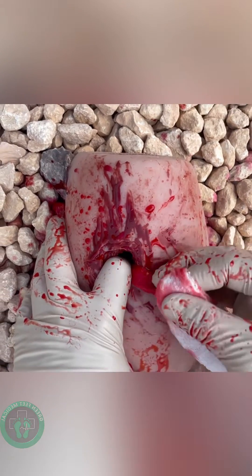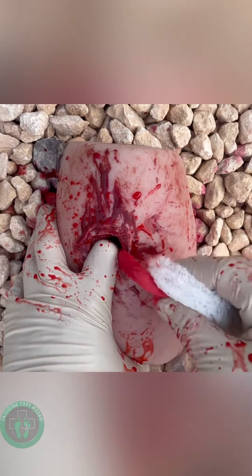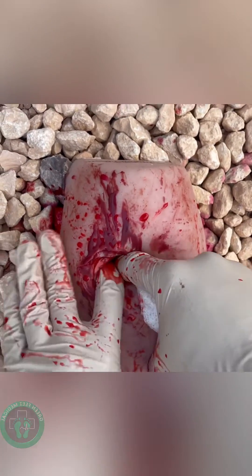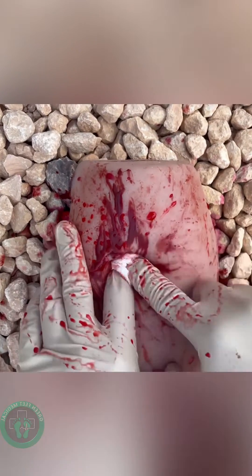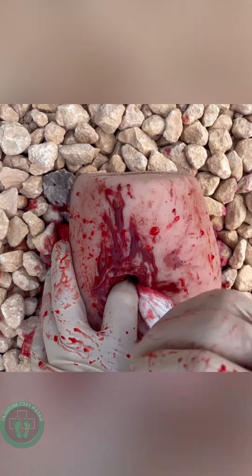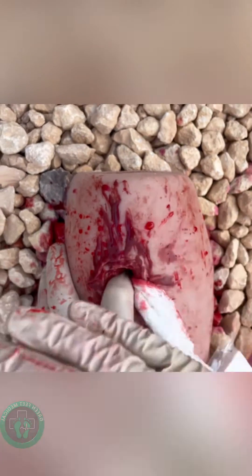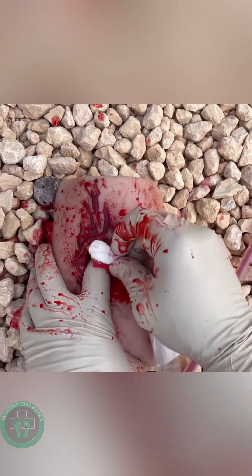Now you're going to want to panic pack, as I call it, because a lot of blood coming out here might be pretty intense, but avoid the urge to just simply shove gauze in this wound needlessly. I'm going to methodically place this directly onto the artery, and once I've built up a good mound of gauze — or a cork on that artery — now I have this cork. I want to have all this void space around that cork filled up with gauze so the cork doesn't fall off the wound.